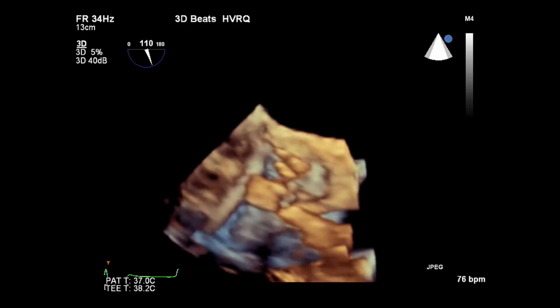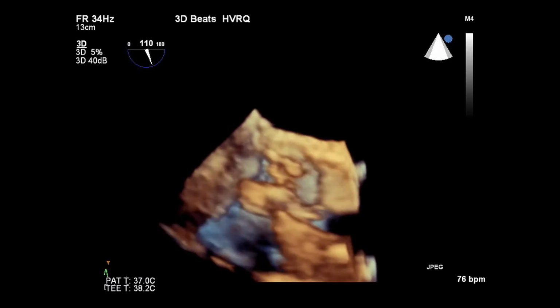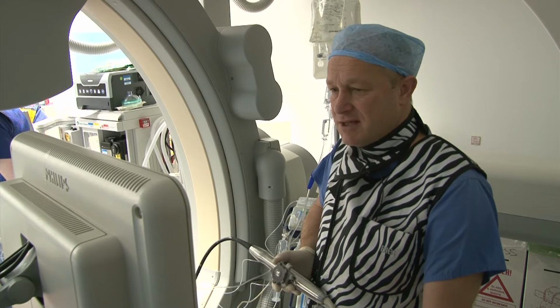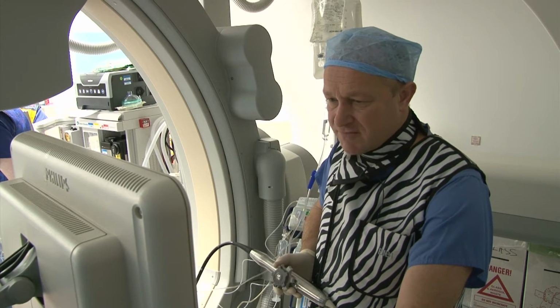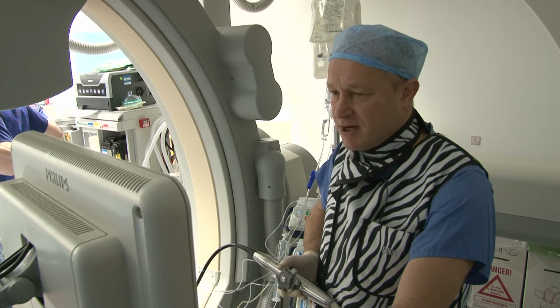So we have a discussion about whether to use extra balloon dilatation in 26 or undersize the 29mm valve. There is also the issue that with the implantation of a larger valve, there is the possibility of compromise of one of the occluders from the mitral valve.